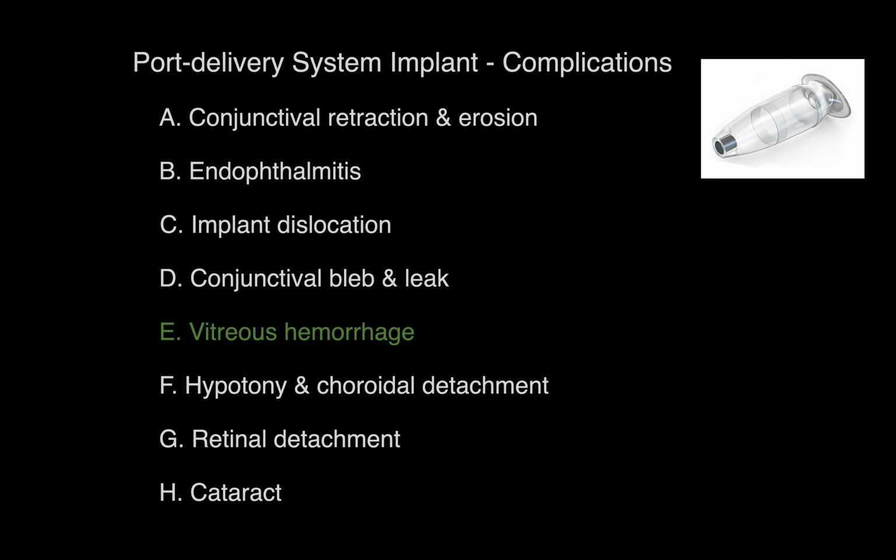The insertion procedure of the implant has been associated with vitreous hemorrhage due to intraocular bleeding from the pars plana or ciliary body in the region of the scleral incision. Implant location should be considered in the decision of the management, either conservative or removal of the blood.